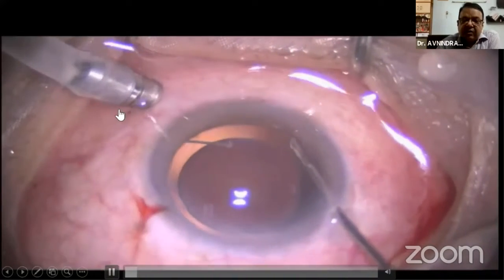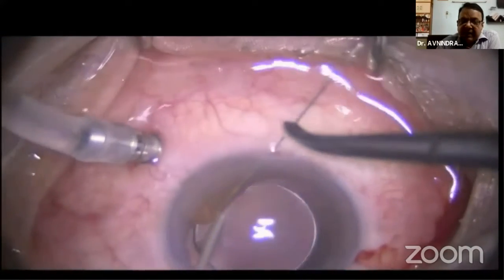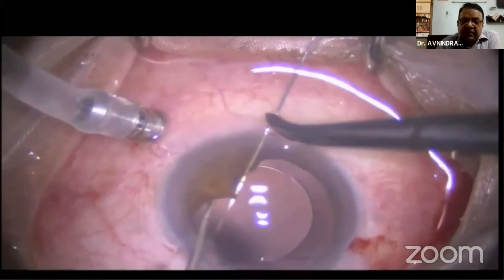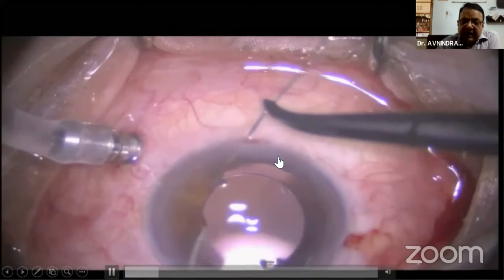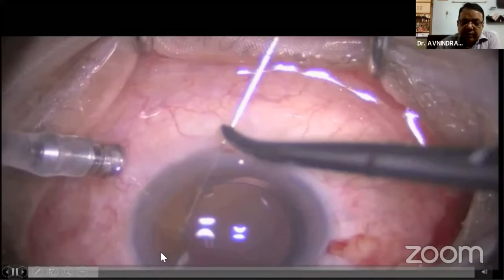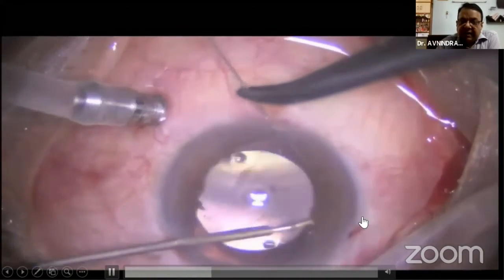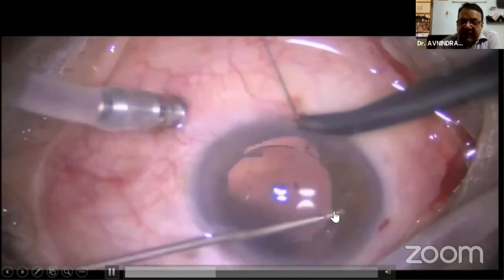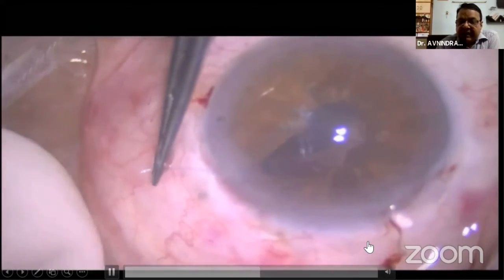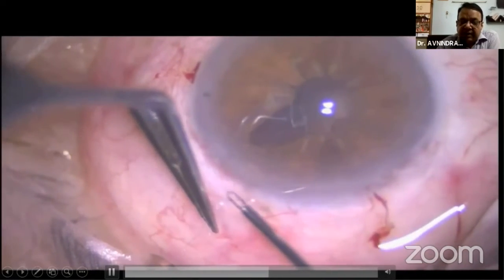And the important thing here is don't put adrenaline into the vitreous fluid or the cannula. The pupil size is checked. You make paracentesis, one at 5 o'clock, one at 10 o'clock, and another at 2 o'clock. So edges of the pupil are taken and it's docked into the needle. This needle is brought out through this paracentesis, and the other end of the needle is again taken, and we take small bites of the pupillary margins and bring it out from this paracentesis. And the third one, we do it again from nasal to the temporal side.